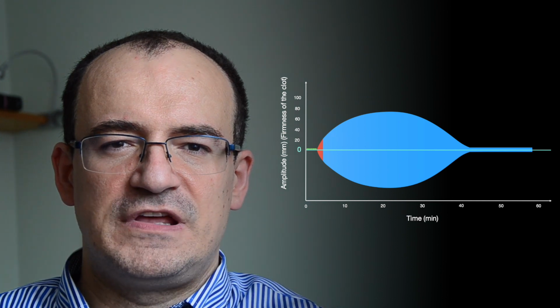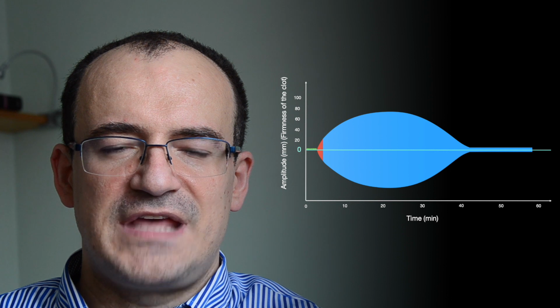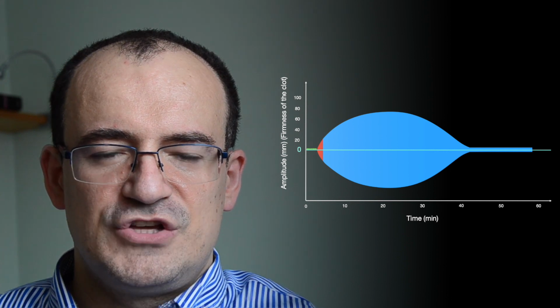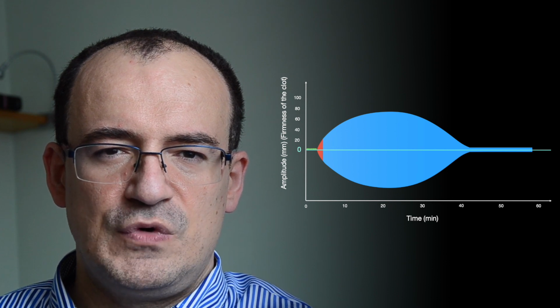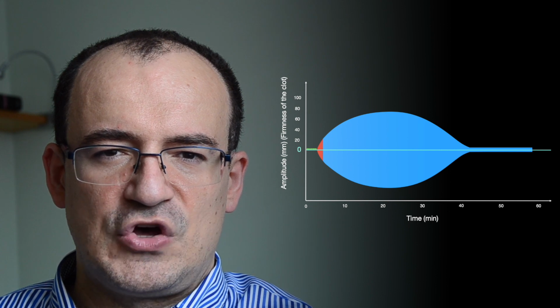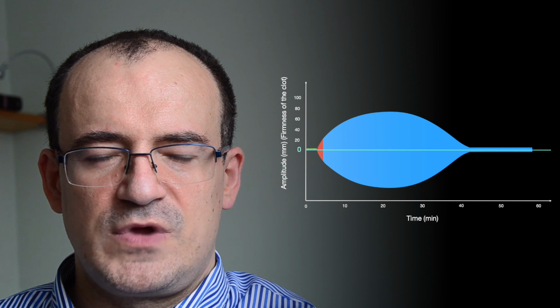At the beginning of the investigation, when the blood sample begins to rotate, the tab stays in place, which is seen as the flat line at the beginning of the curve. Soon after, a clot begins to form and the record moves further and further away from the null position as the investigation goes on. It reaches a maximum at one time and the clot width doesn't increase any longer.